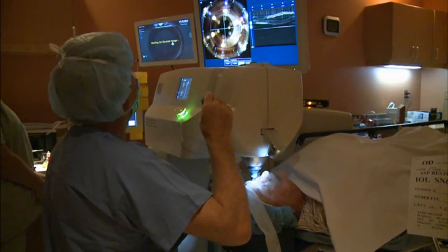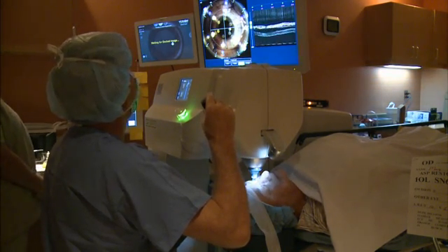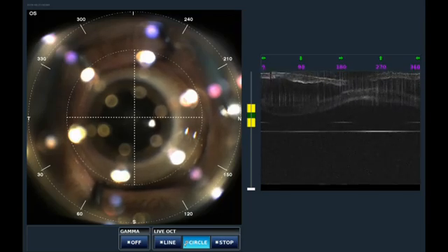This is a case where we're going to implant a T7 toric lens, a 16.5 diopter, using the femtosecond laser.